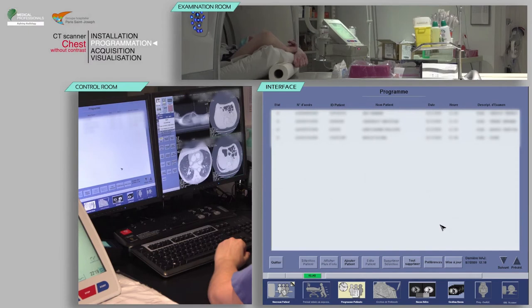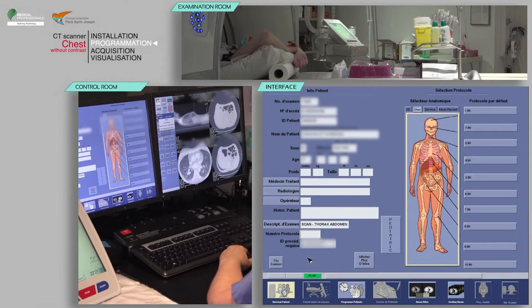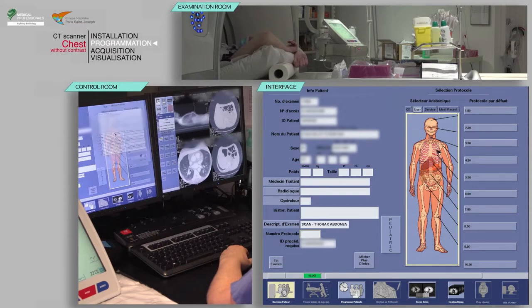Select your patient from the work list, then click patient selection. Verify that the pre-filled information is correct, and fill in your patient's weight and height.